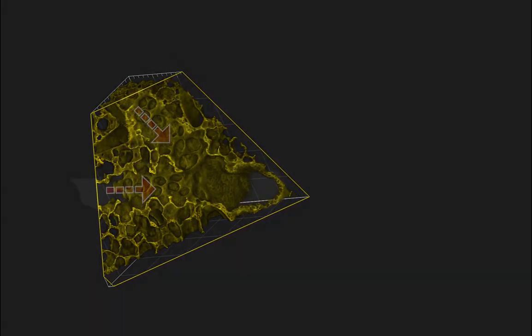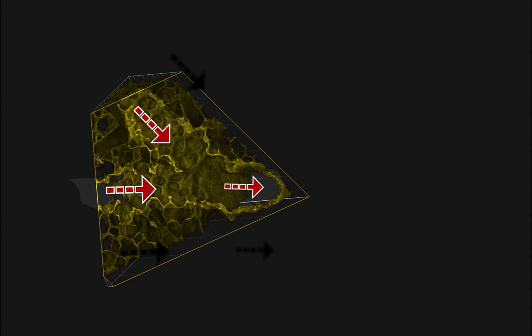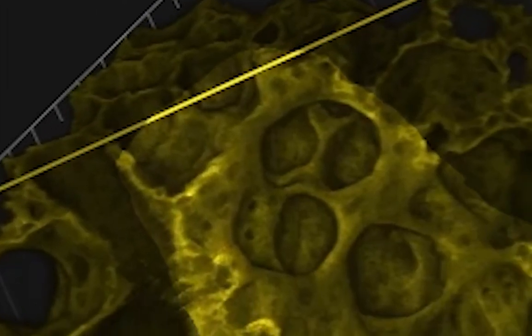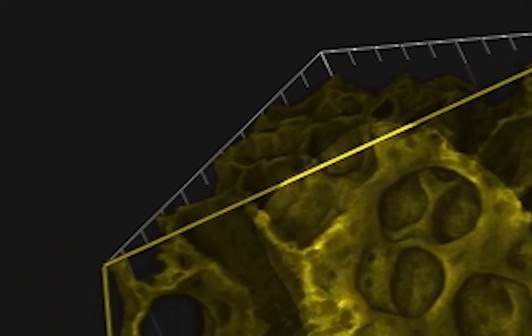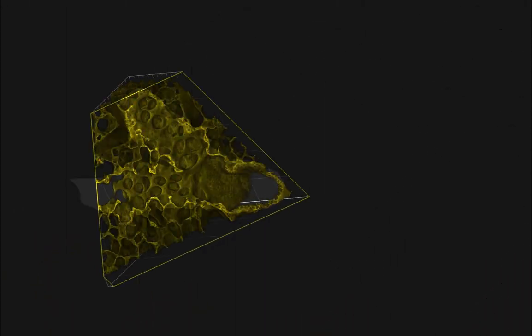Beautiful. So this is an airway. Here we can see, going down the peripheral airway, you can see these little holes here, and particularly this one, are down out of the side of the airway into families of air sacs that arise from the side of the airway. Now, during development, this airway size is expanding.